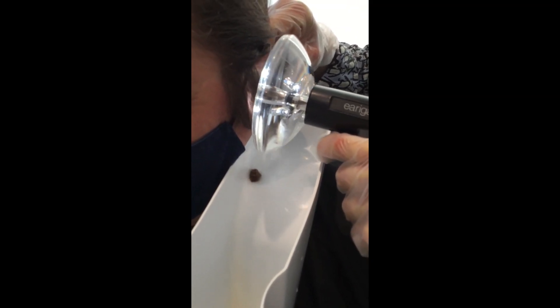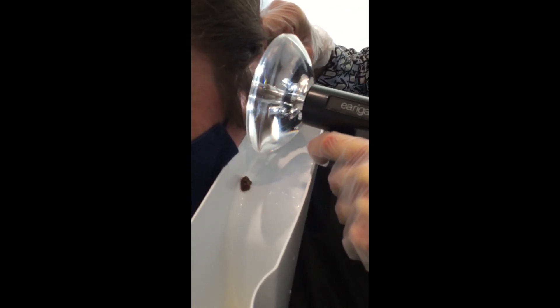It just came out, I think. Oh yeah, that was a big chunk in there.